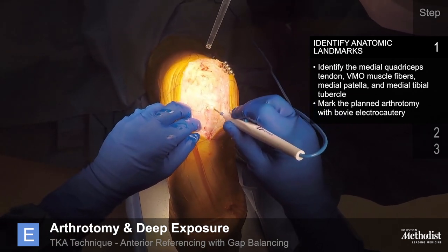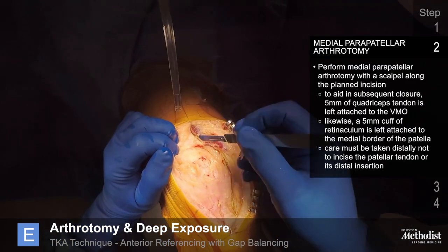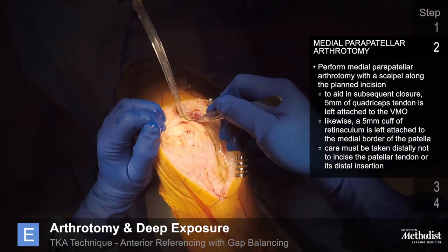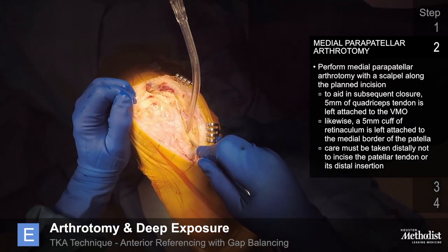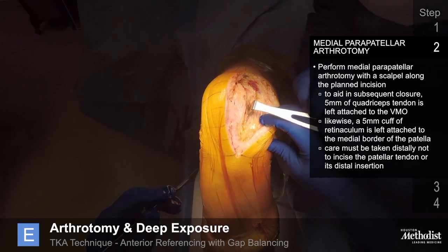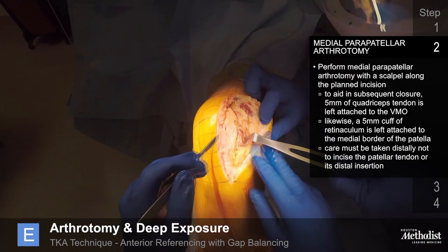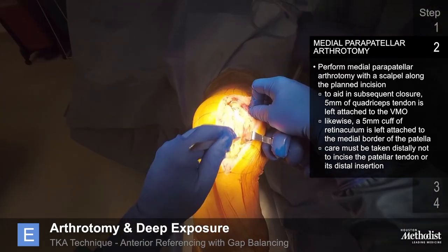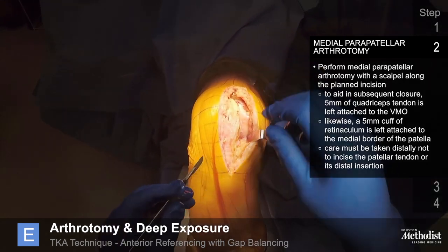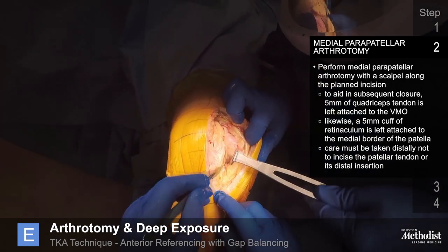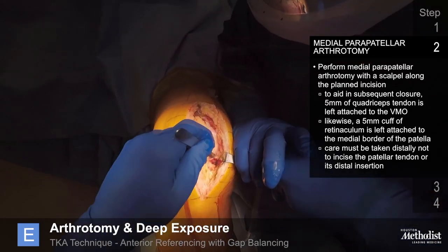Place a finger at the lateral soft spot and palpate the medial patella and the border of the patellar tendon to define the arthrotomy. Mark the planned arthrotomy with bovie electrocautery, then perform the medial parapatellar arthrotomy with a scalpel along the planned incision. To aid in subsequent closure, 5 mm of quadriceps tendon is left attached to the VMO. Likewise, a 5 mm cuff of retinaculum is left attached to the medial border of the patella. Care must be taken distally not to incise the patellar tendon or its distal insertion.